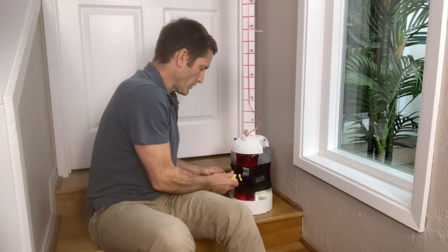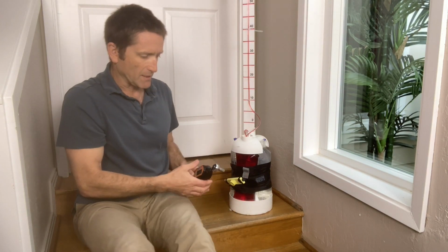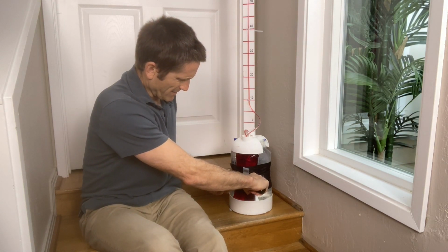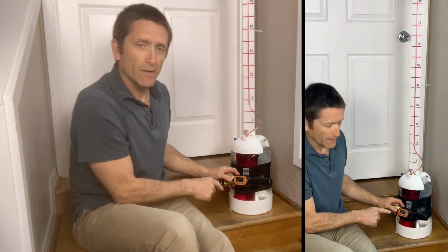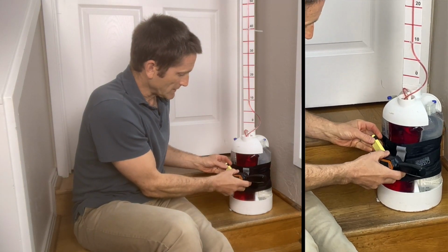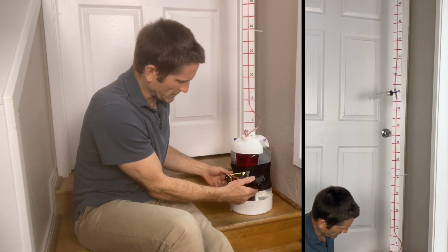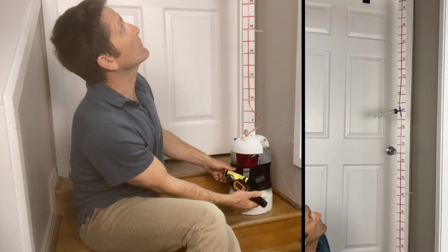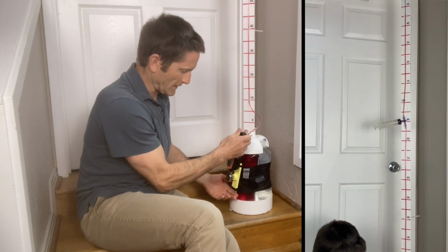And I'm going to attach my torque wrench. And let's just see where this lands. I turn it on. Make sure I'm at Newton meters. I clear it. All right, here I am. I am at 0 torque because my arm is not on it. I'm going to turn this. All right, right now it's about to catch, and let's see what that first, so 0.98 gets me to 140 centimeters of water, and now I'm going to do another 180 degrees.